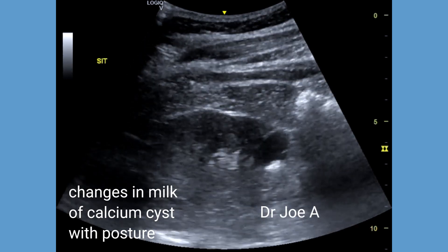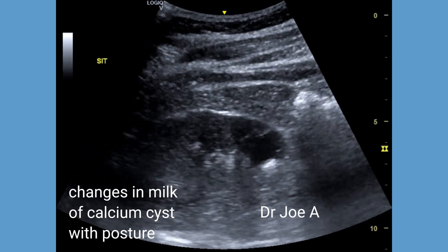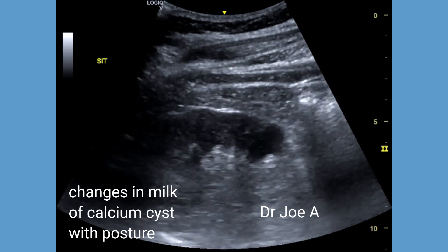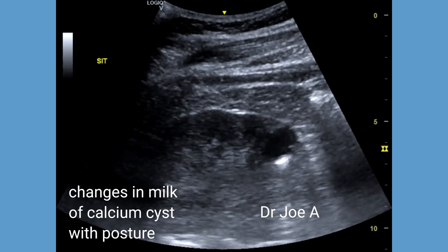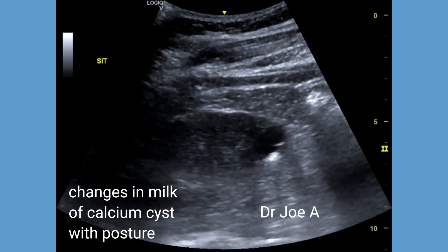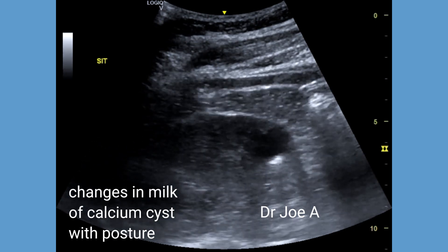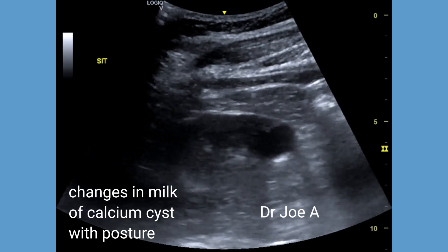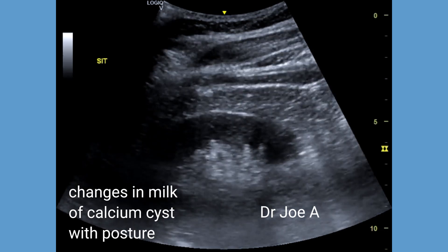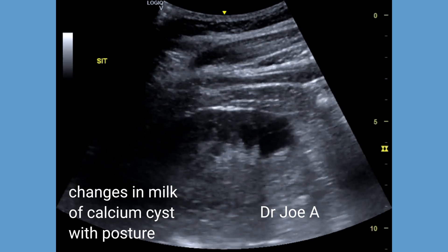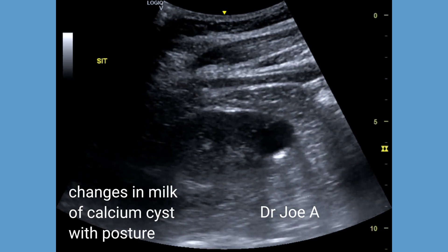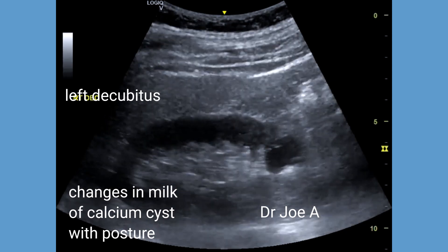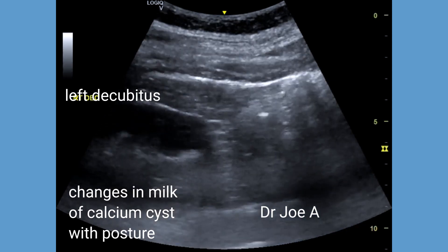A milk of calcium cyst must be distinguished from a renal calculus. The changes in the characteristic of the milk of calcium crystals suspended in the cyst with changes in posture is one of the main differentiating features from a renal calculus on ultrasound.